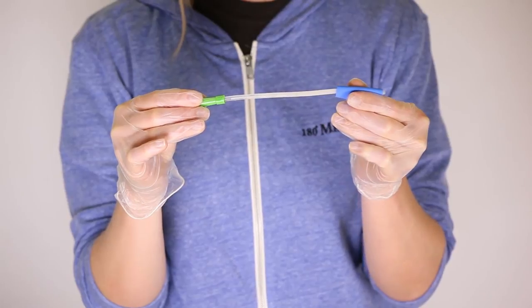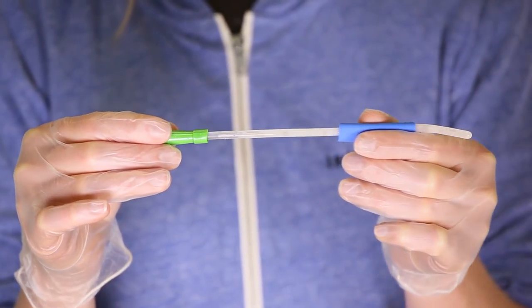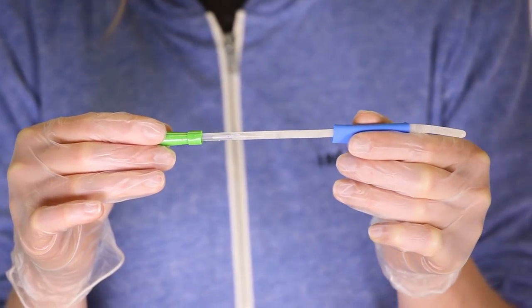While holding the protective sleeve, simply proceed with your cathing process as normal, using the blue sleeve for a better grip and to keep your hands from touching the catheter.